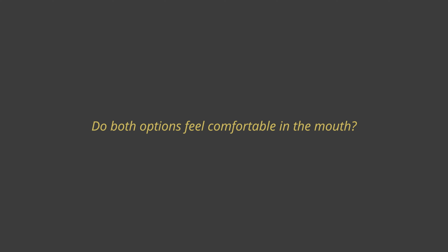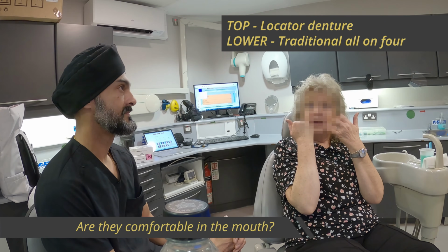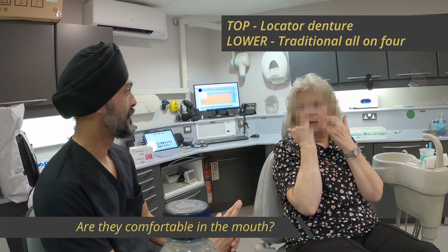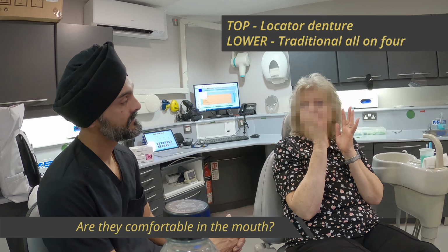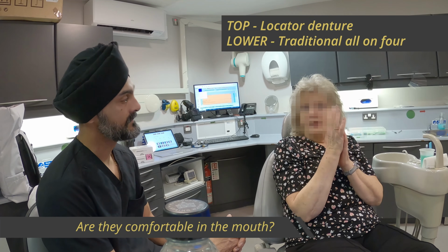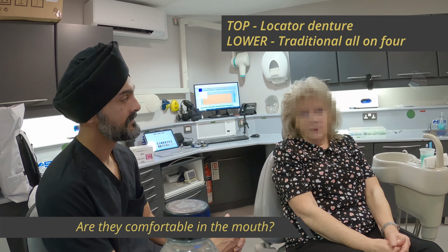Well, when we first did it, there were these extra wings on it. That wasn't too comfortable. Oh, the top one? Yeah, because we reduced that in size. We took it off, and it made a lot of difference. You can still feel the thickness. I don't think the thickness is a real problem.